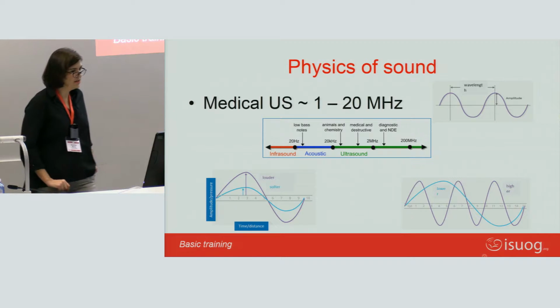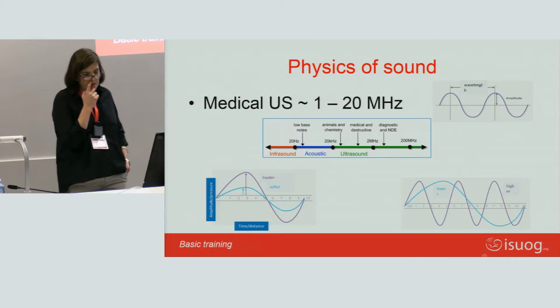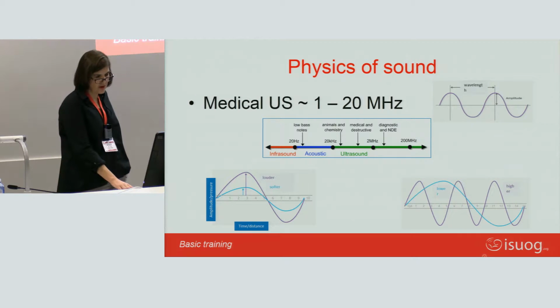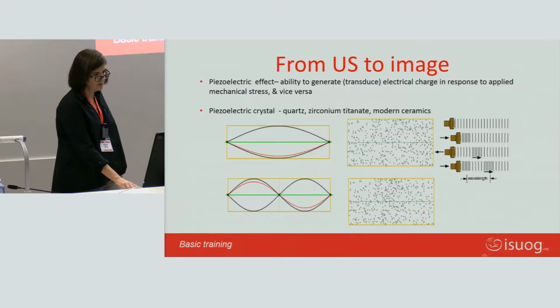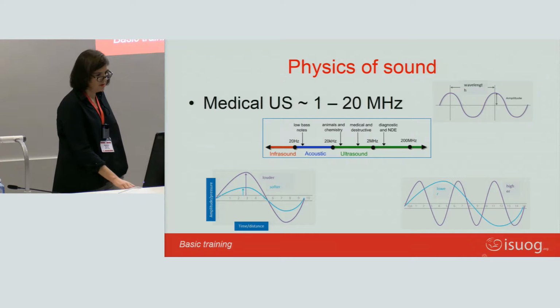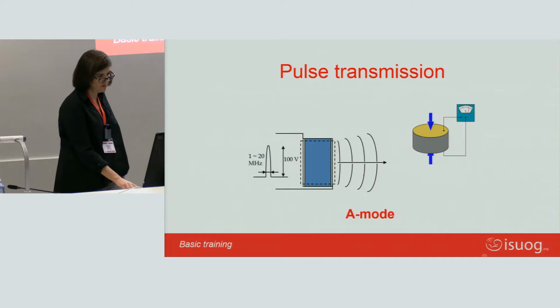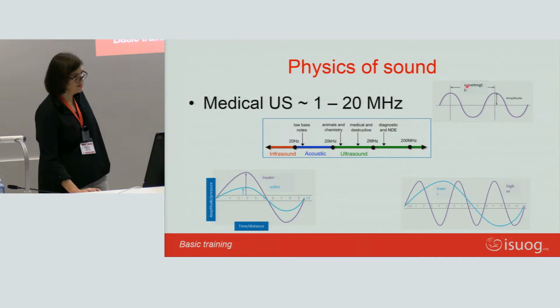Now we can actually represent this vibration of sound in a mathematical way as a sinusoidal waveform. I just want to show you that. Sorry about this. There we go. This is not the right size. I'm sorry about this. Okay, there we go. As a sinusoidal waveform.